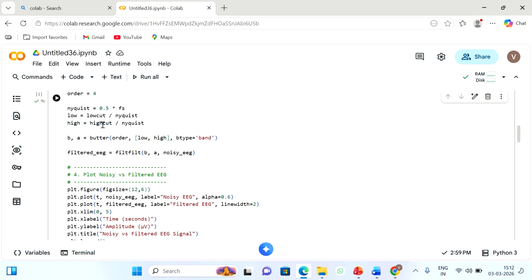But in case of EEG, the electrodes are placed on the scalp, and in between there is an insulation layer. That is why pure conduction will not happen, that is, 100% conductivity will not happen. So the EEG amplitude will be very small when compared to ECG or any other electromedical signal.